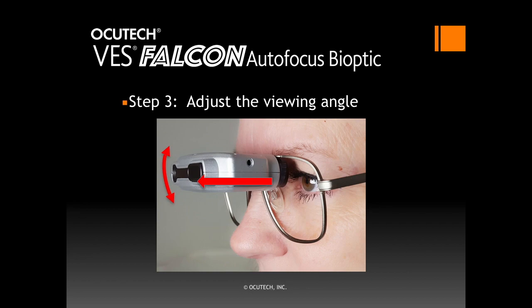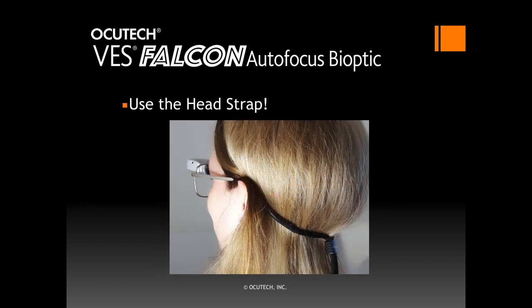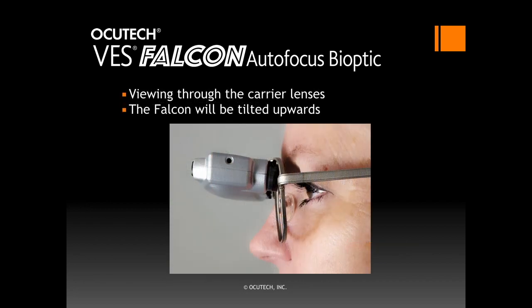When positioned properly, the patient will report that they can see a full round field of the telescope. Now remove the Falcon and tighten the two rear bridge screws until the Falcon is snug but without over-tightening it. It's desirable to use the head strap provided to keep the Falcon in place without slipping down the nose. Tighten the bead on the back so it is snug but not tight. When the patient is looking beneath the telescope through the carrier lenses, the Falcon will be tilted slightly upward.